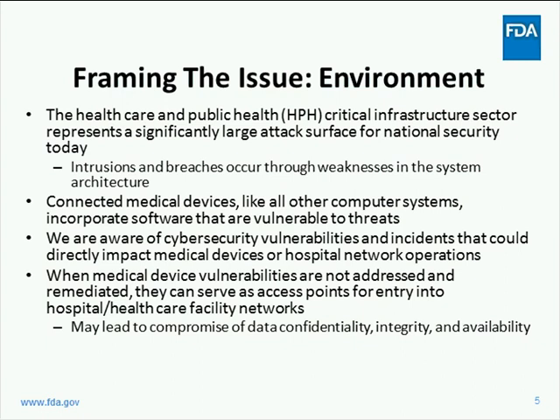Security vulnerabilities can directly impact medical devices or hospital network operations. And when medical device vulnerabilities are not addressed and remediated, they can serve as points of entry into hospital and healthcare networks. This can lead to compromise of data confidentiality, integrity, and availability. Worse yet, it can introduce safety concerns for the patients who rely on the safe and effective use of their devices, whether in the hospital, at the bedside, at home, or implanted.